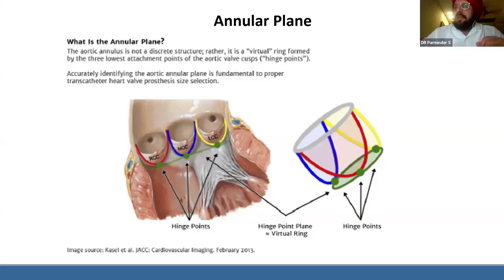I think that's fine, but sometimes the patient may give some tilt during the cath lab procedure. Some patients may move. Whenever we are acquiring the angiographic images, the patient should be stable, lying supine, totally flat. We need to be careful and keep it in mind that this is what we want.